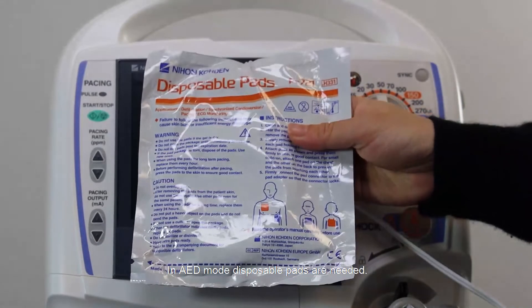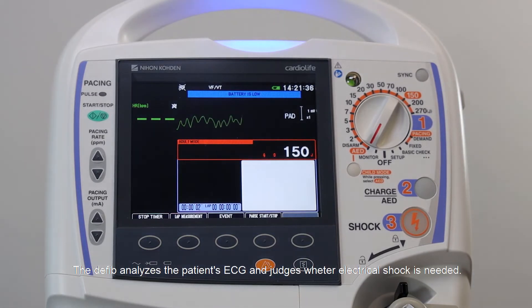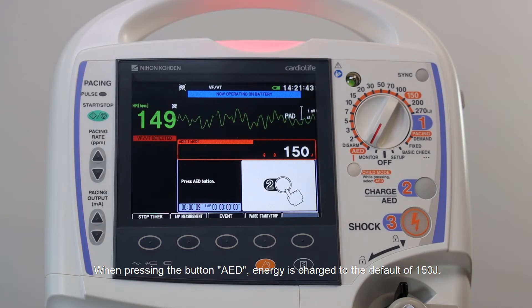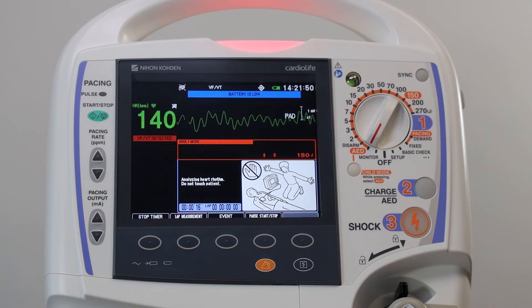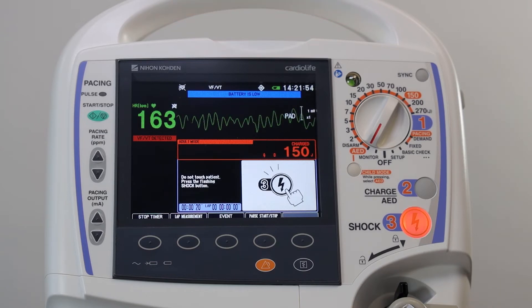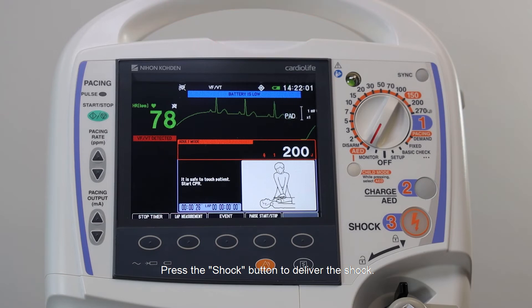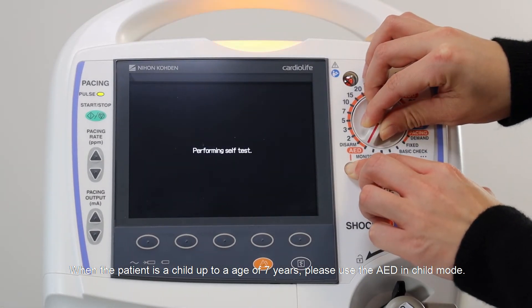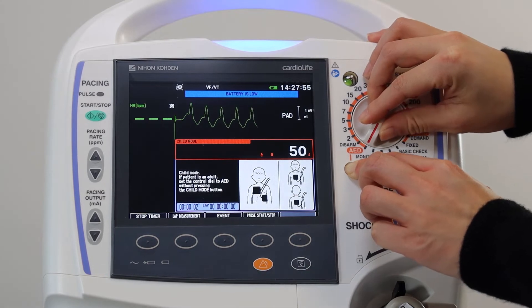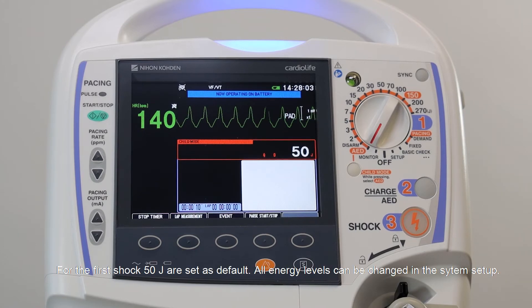In AED mode, disposable pads are needed. The defibrillator analyzes the patient's ECG and judges whether an electrical shock is needed. When pressing the button, AED energy is charged to the default of 150 joules. Voice prompts guide the user: 'Do not touch patient. Shock advised. Press the shock button to deliver the shock. It is safe to touch patient. Start CPR.' When the patient is a child up to 7 years of age, use the AED in child mode. For an adult, set the control dial to AED without pressing the child mode button. For the first shock, 50 joules are set as default in child mode. All energy levels can be changed in the system setup.